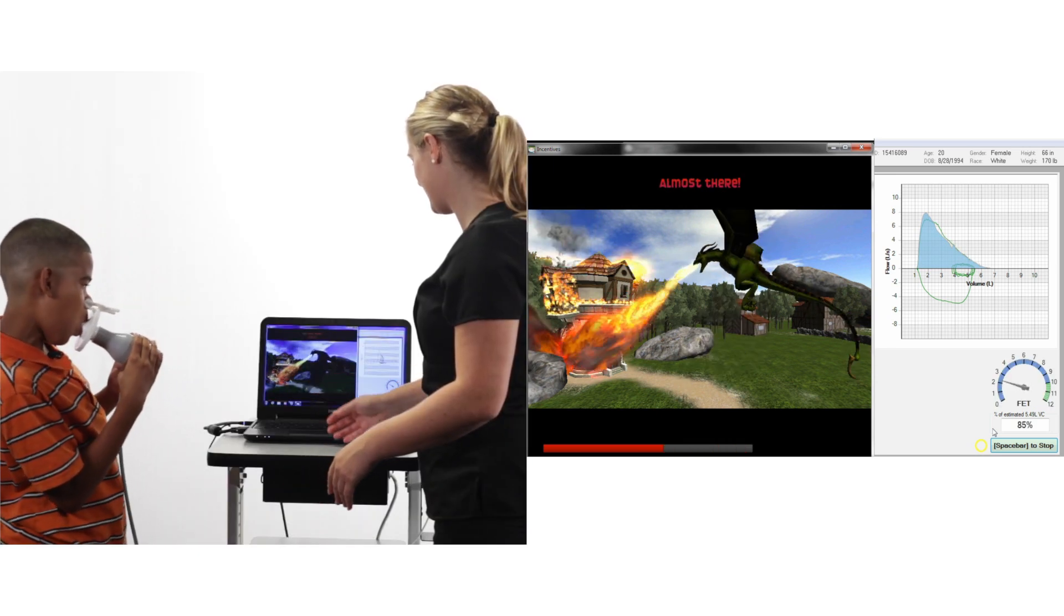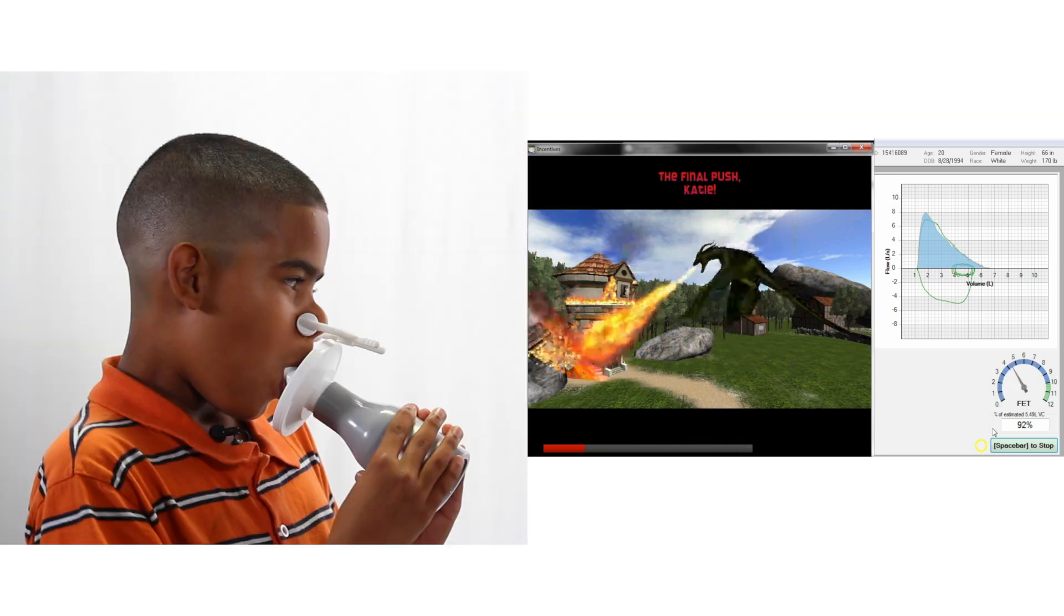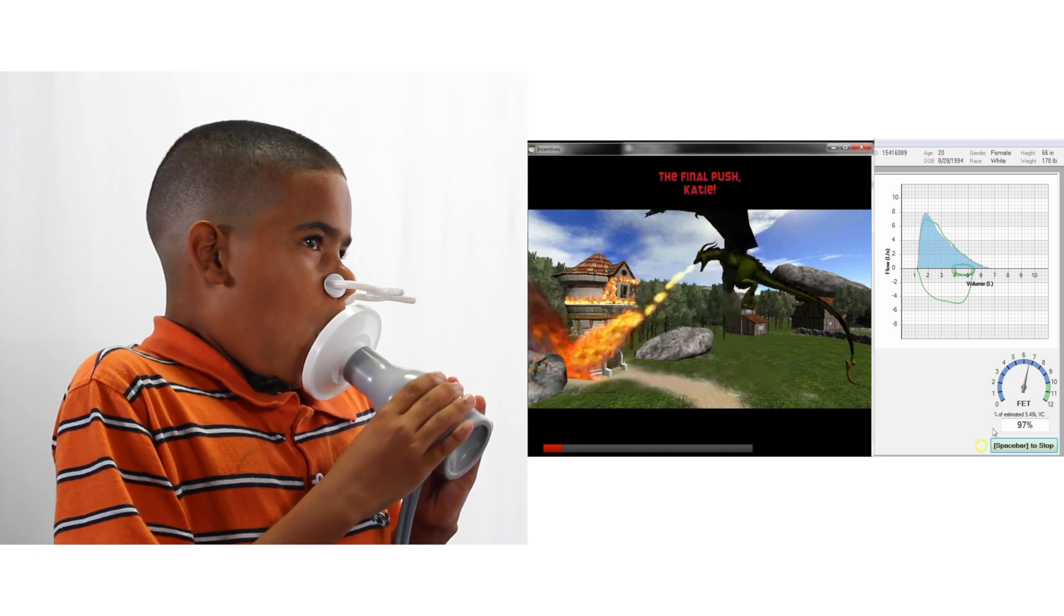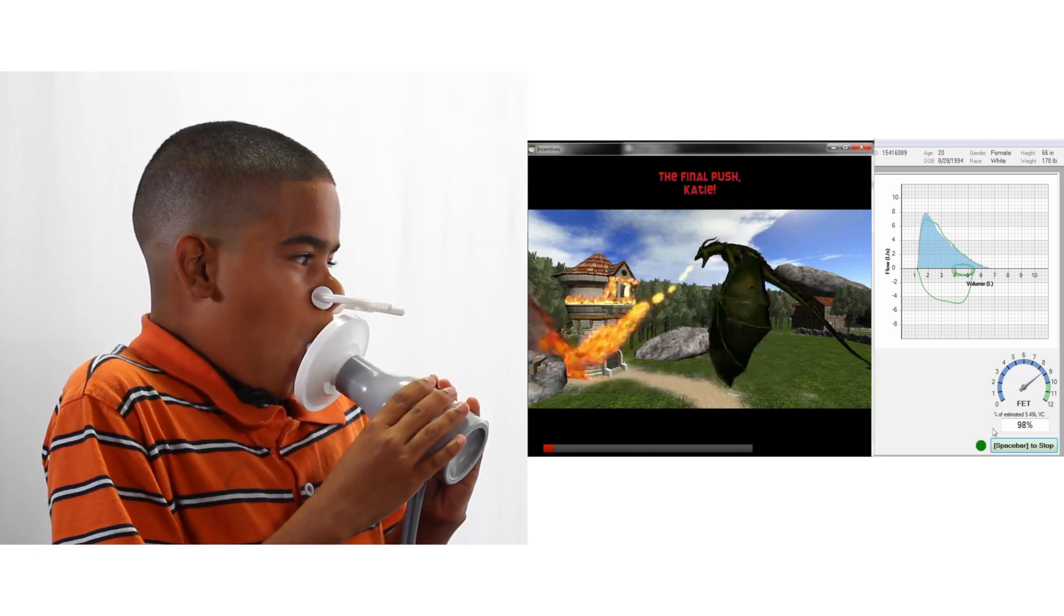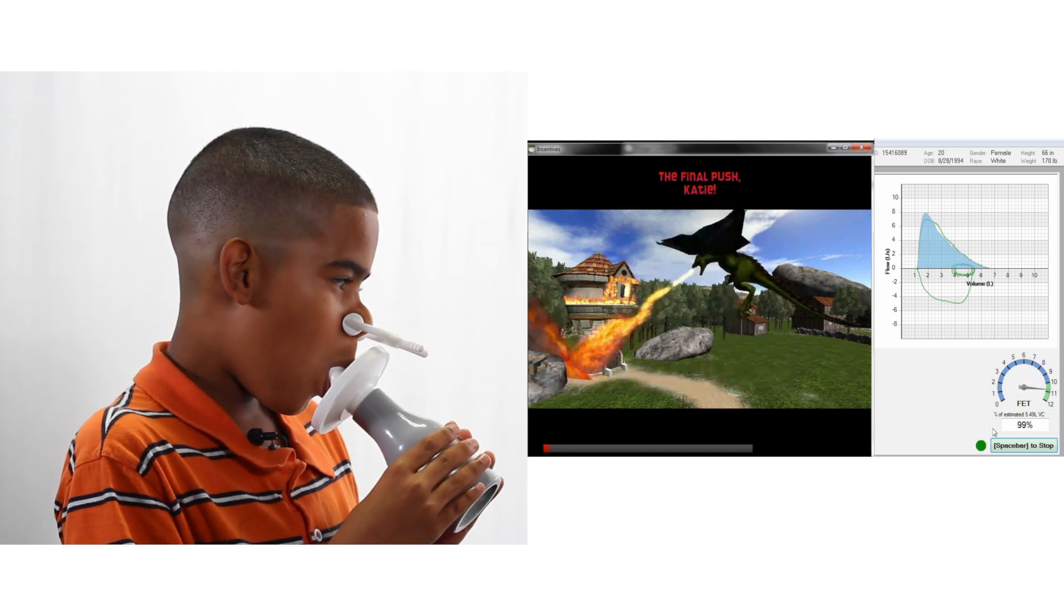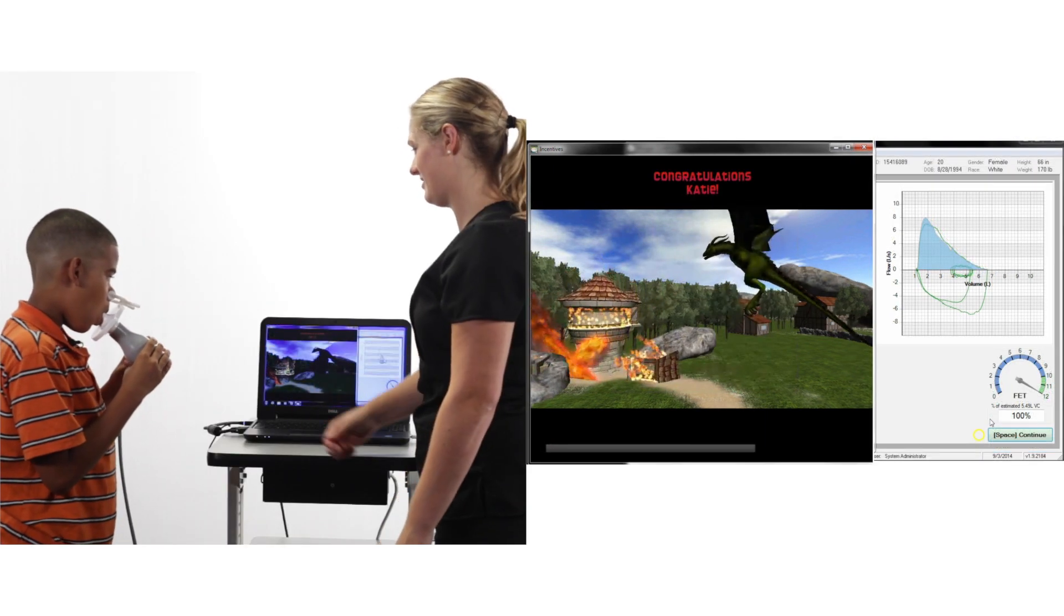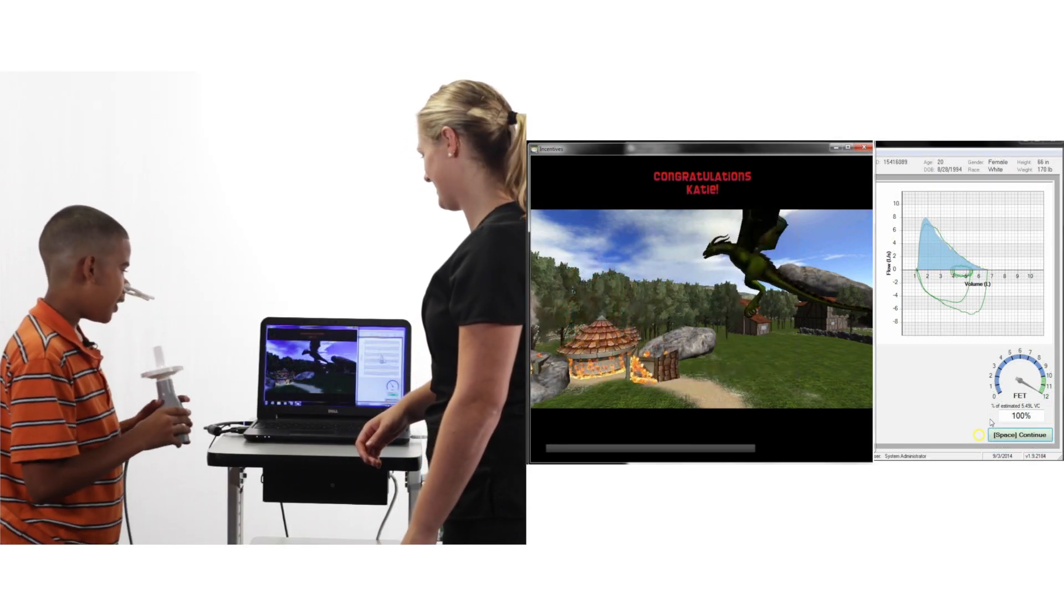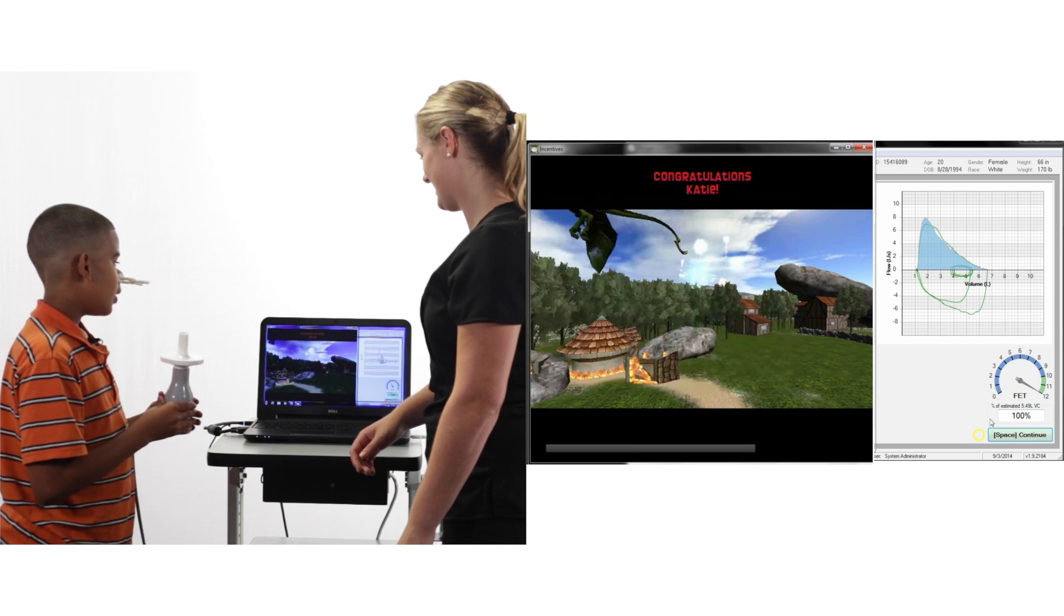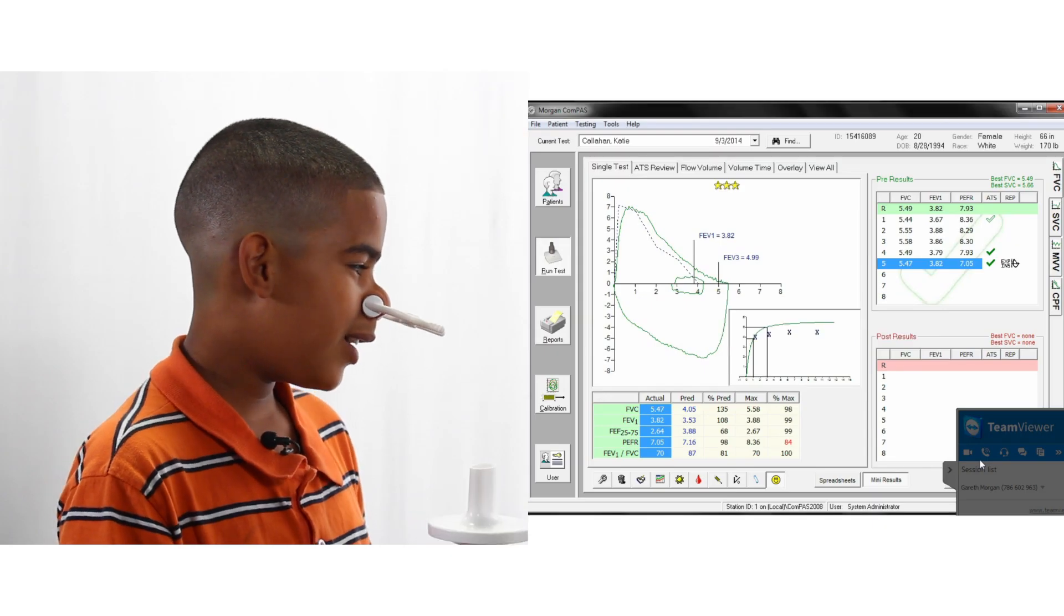In Compass, the incentive screens have post-test success and failure animations, which can be turned off if desired. For success, the user can allow end-of-test criteria to be used even if the percent FPC has not been achieved.